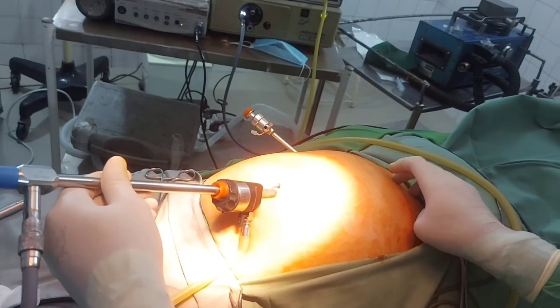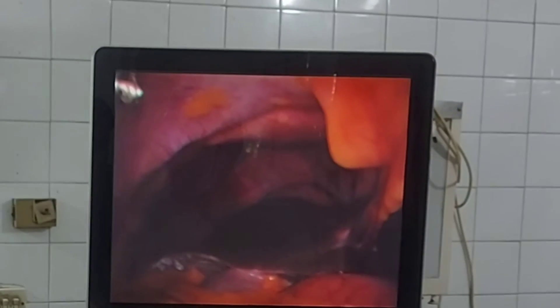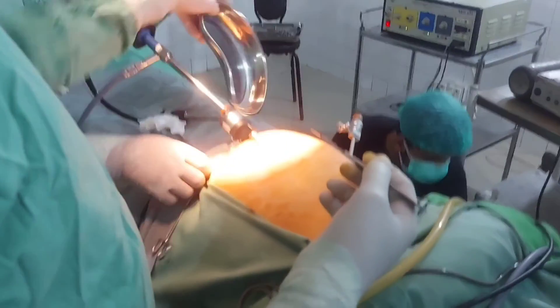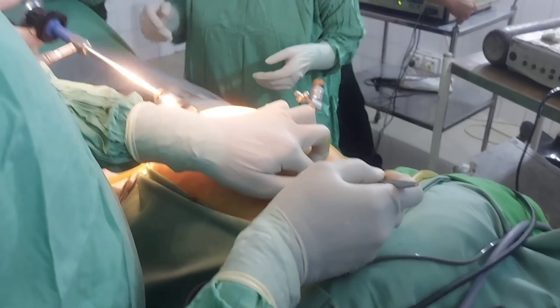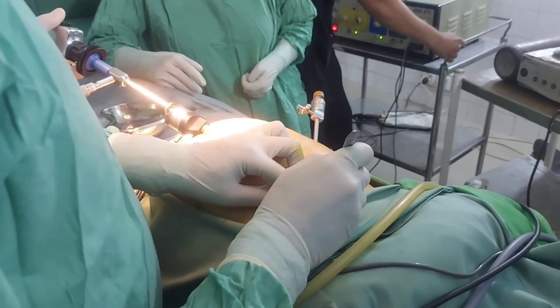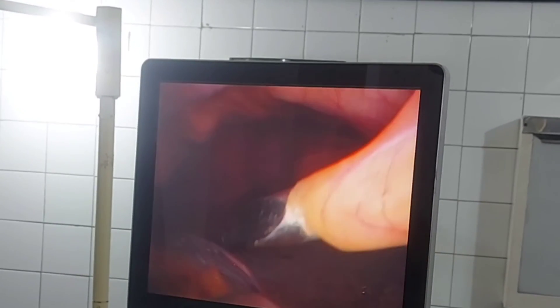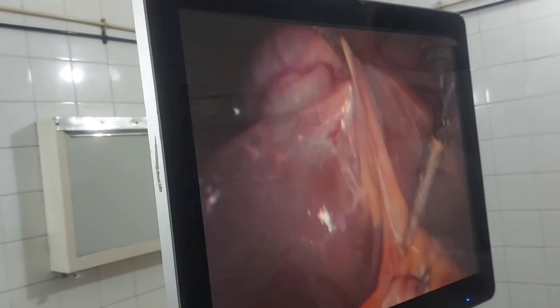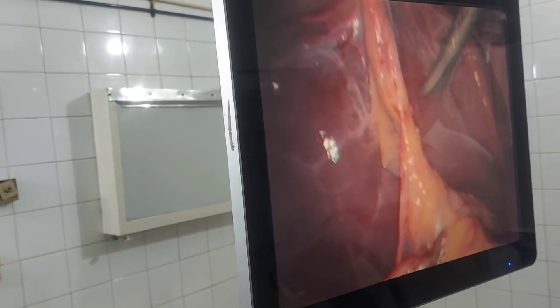Another port is passed in the sub-xiphoid region; this port is also 10 millimeters in diameter. Port site entry should be approximately 2 centimeters below the xiphisternum. The laparoscope incision should be approximately 10 millimeters in size, just toward the right side of the linea alba, and this trocar should enter toward the right side of the falciform ligament.